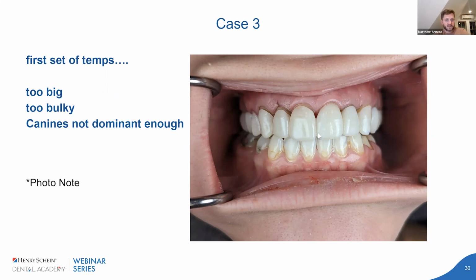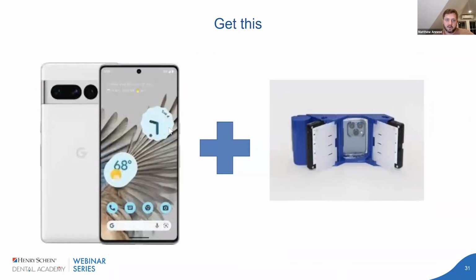So for me, we started implementing this protocol. So this is what this note is. This is something that I would strongly recommend implementing right away. We got Google Pixels because we all run on G Suite. All our emails are Google emails through the practice workspace. So, with the Pixel 7 and with this light box, I can create a whole separate email of just photos@yourworkdomain.com. And that way they know whenever they need photos, they're going to take these photos with basically this little setup that's magnetic that takes all the photos that you've seen through this procedure or process.